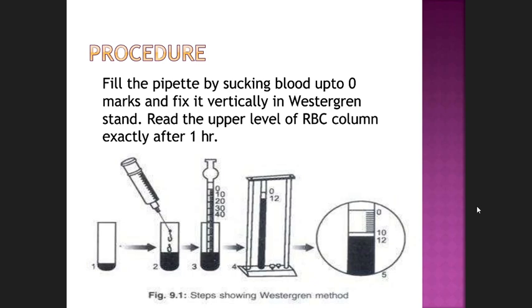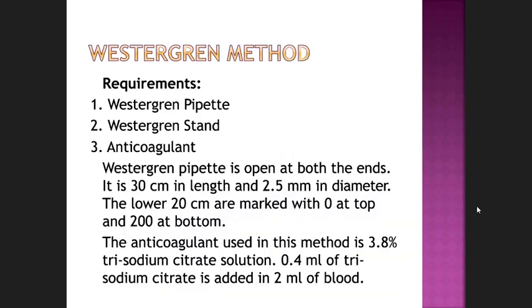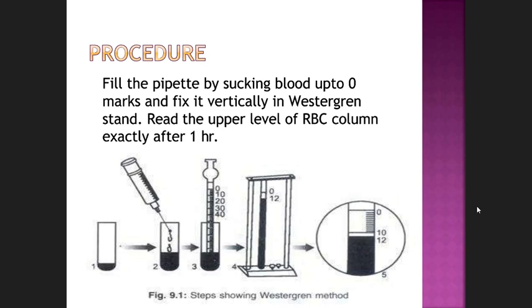So we mix the blood with the anticoagulant, fill the Westergren tube up to the 0 mark, and fix it vertically in the Westergren stand.